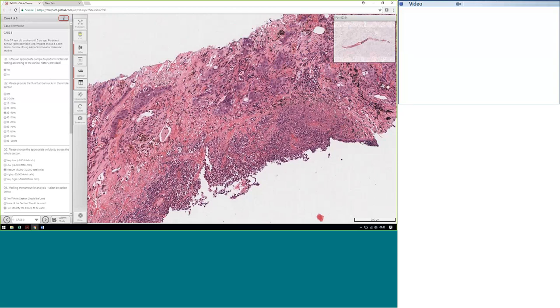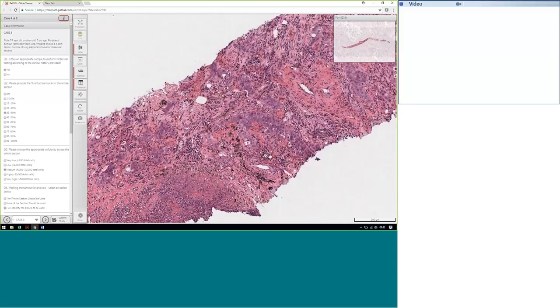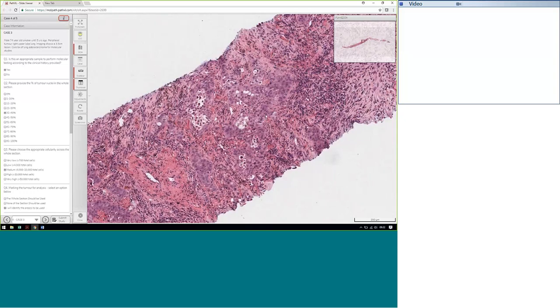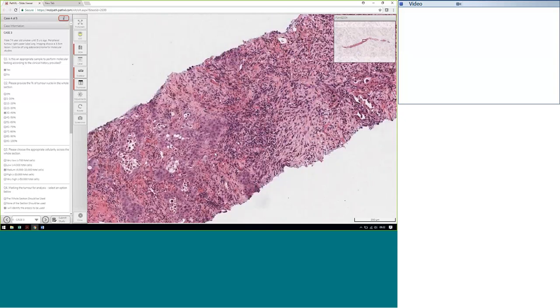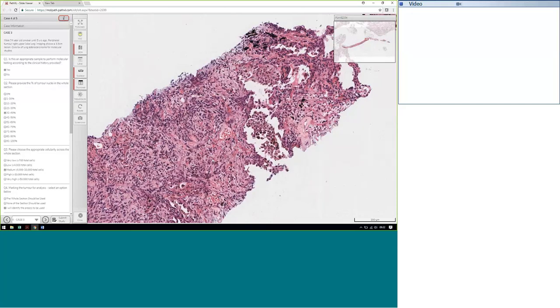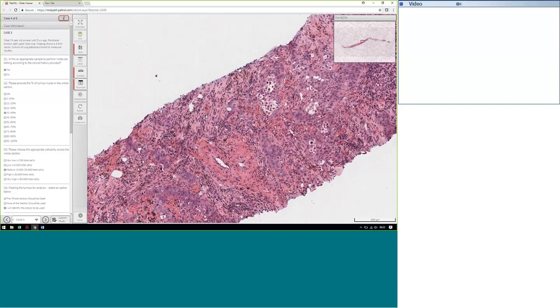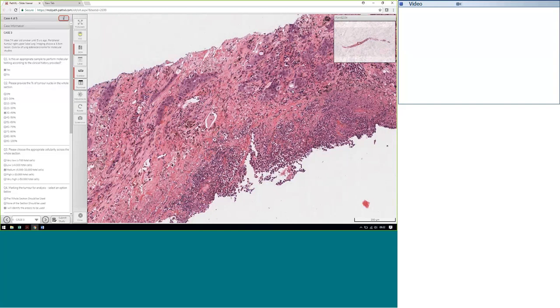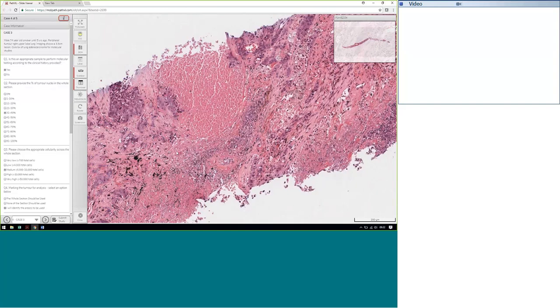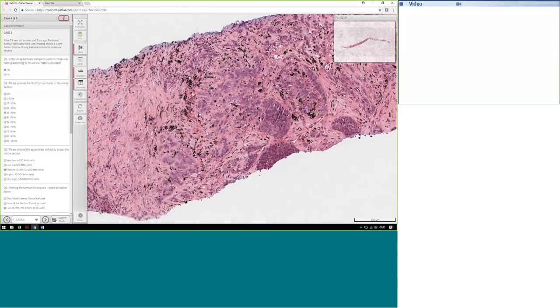So going on to the cellularity, the experts decided it was medium cellularity because there are a considerable number of nests of tumour cells throughout the core. And with the 5 by 10 or 10 by 5 sections, that gives you a medium cellularity and sufficient for most downstream applications. Harry? Yeah, that's exactly what I was thinking, that it goes up to medium because of certainly the numbers of cells. Thank you.